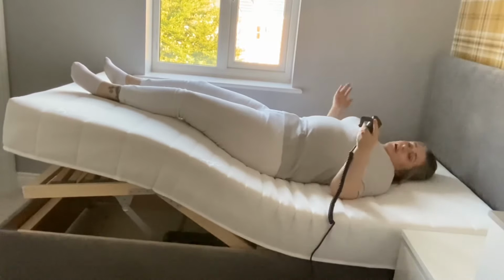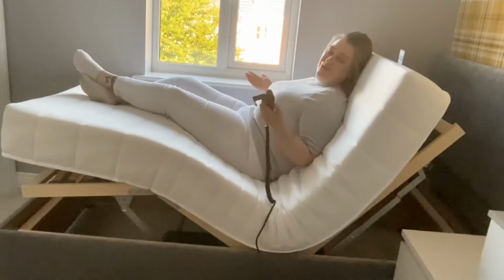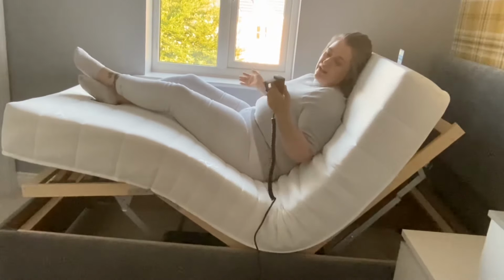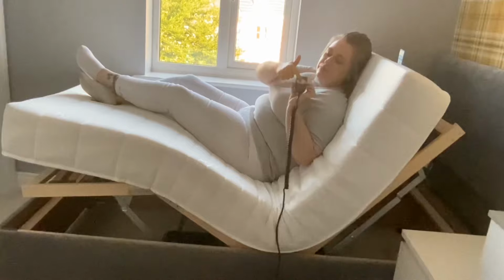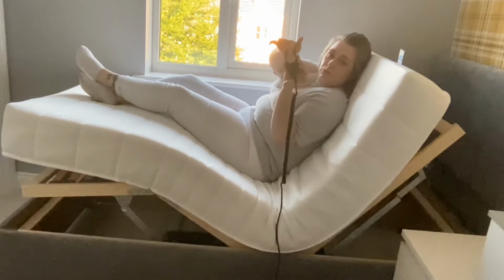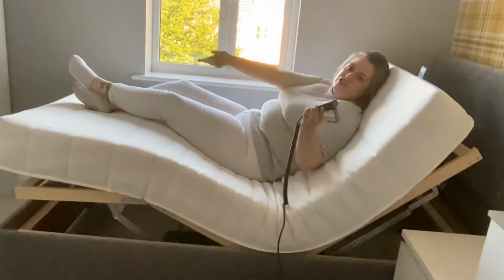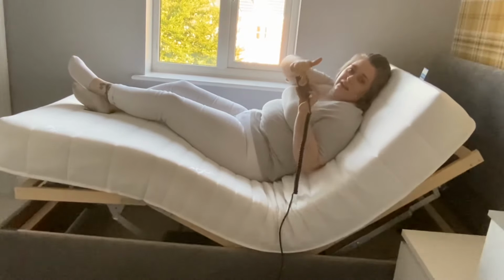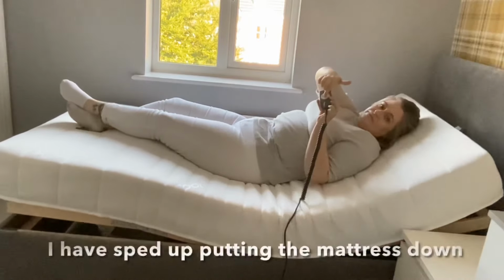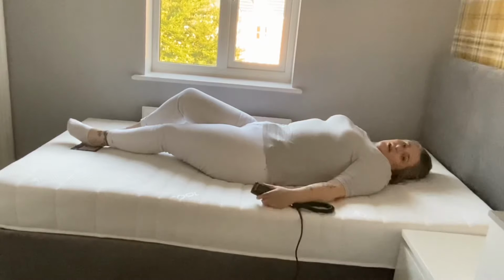And let's fold myself in half and bring the top half up too and see what happens. So there you go, the bottom half of the bed is raised, the top half of the bed is raised, and this is what it looks like. So again, you can press each button if you want to lower each one, or you can just press the middle one, and if you take your finger off it stops. But yeah, just keep your finger on the middle one and both of them decline. And there we go, we are flat again.